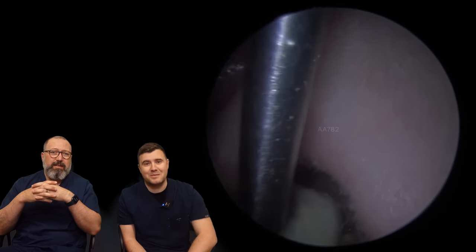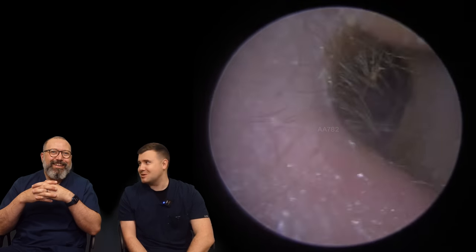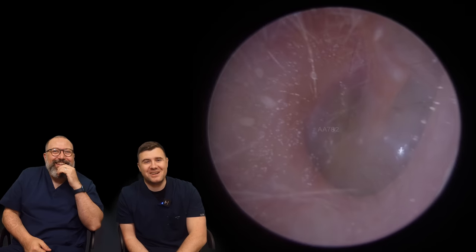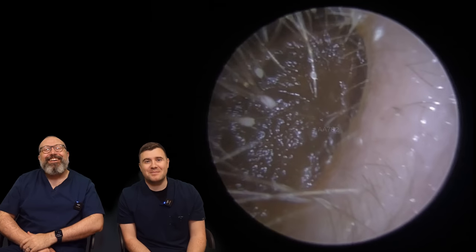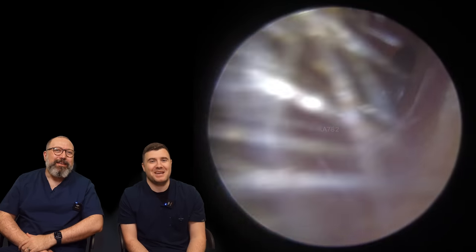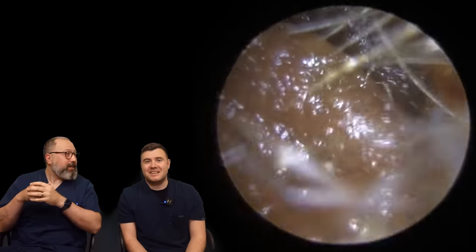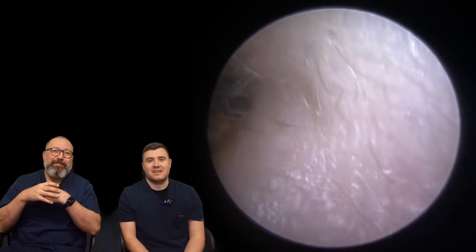So this is going on to my patient now — we finished the second one already, we're just talking too much. Pretty quick one on this one, it came out nice and easy. It was a plug with a lot of dead skin around the ends. And the ears were lovely — they looked nice and healthy.